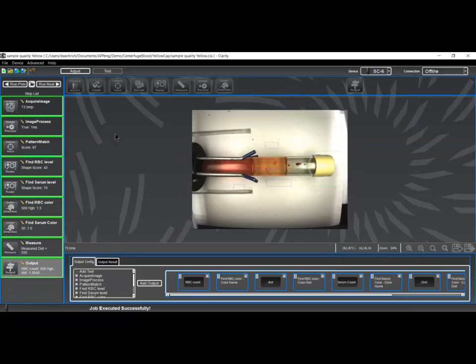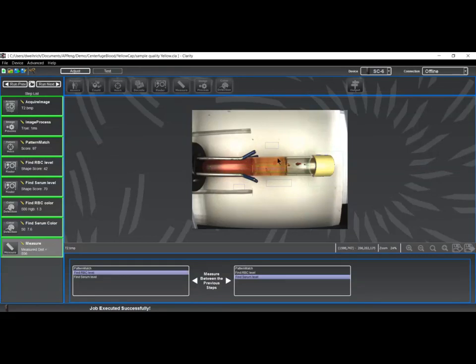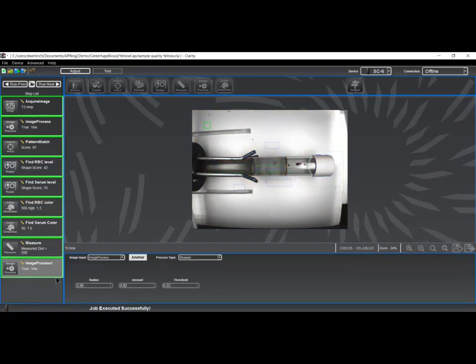One approach for this is to measure the uniformity of the color in this area, or I should say of the shading in this area. I'm going to remove this output step here. One thing that enhances the contrast of an area is what we call a histogram equalization. So I'm going to add an image process step, and it's working from this monochrome image that was created above here. I'm going to anchor it to the serum level because I'm only interested in the level that is associated with the serum area.